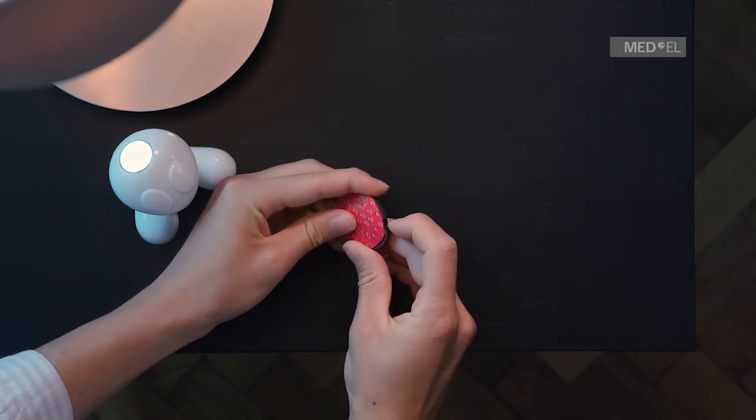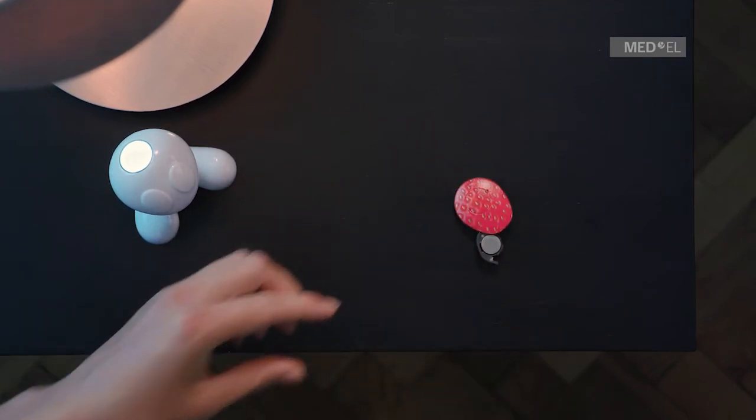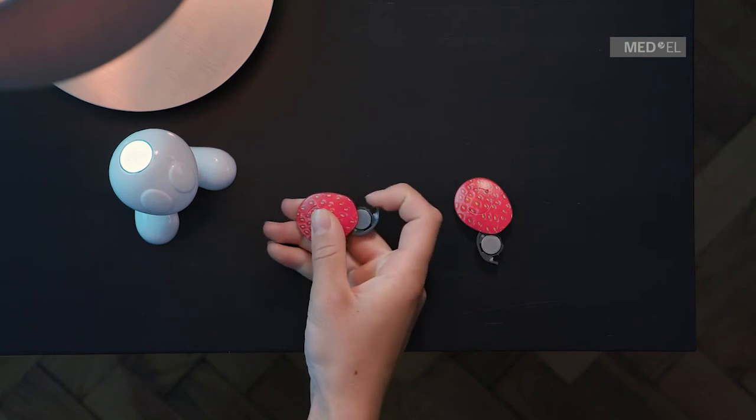To switch off Samba 2, reopen the battery compartment by pulling on the raised lip to swing the battery compartment open sideways.